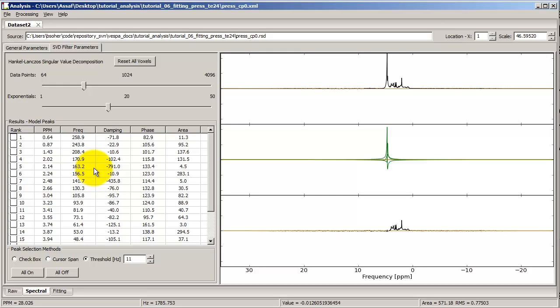So the SVD algorithm is a mathematical operation which tries to fish out or to decompose your signal as a sum of decaying exponentials in the time domain, or in the frequency domain as a sum of peaks. What this means is that given your spectrum, it's going to try and decompose it into individual peaks. And this is useful if you want to filter out specific peaks. For example, a large water resonance.